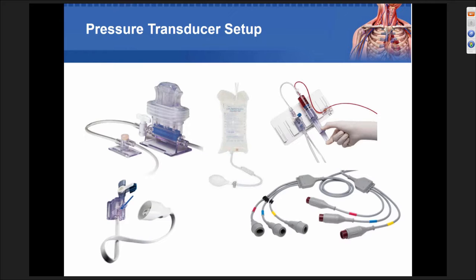On the right-hand side, all the way over to the right-hand side, is a different apparatus. Again, it's in a closed system. It's a little different type of transducer. It has a blood waste chamber, and then the blood, again, is given back to the patient. There are no disconnections and reconnections because doing that adds risk to the procedure, but more so to the patient from an infection prevention standpoint. In the middle, there is the pressure transducer bag. And when I refer to the bag needing to be inflated or the bag hanging, that is what I'm referring to.